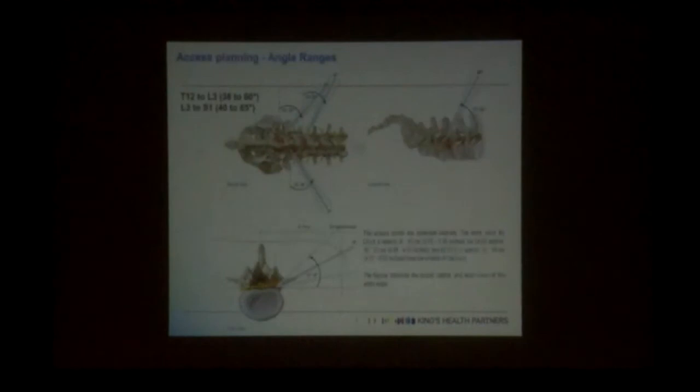So that's how I mark. I wish we could have shown you that surgery, but we couldn't manage it this time. So this is the midline I marked, 10, 12, 14. That marking depends upon the size and the level of the disc we are trying to remove. The higher you are, the less angulation you need. The lower you are, the more angulation you need.